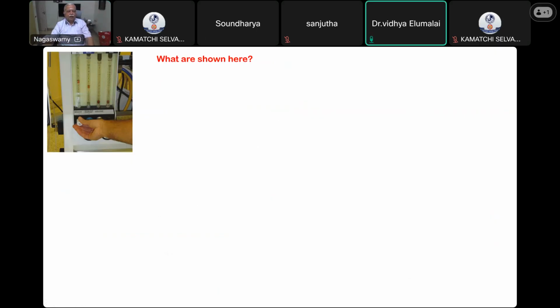Flow meter. Come out with the answer fast, because how many flow meters are there? Is it a single flow meter or double flow meter? Single flow meters. The single flow meter for 4 gases. Okay, so you can see the names written very small here. So oxygen, nitrous oxide, CO2 and air. So all the 4 are written. Oldest machine only will have CO2, and somebody is holding the knob for oxygen to open that, and nitrous oxide is also flowing already, whereas the carbon dioxide and the air are at the bottom. Okay, so they are single flow tubes, flow meter for different gases.